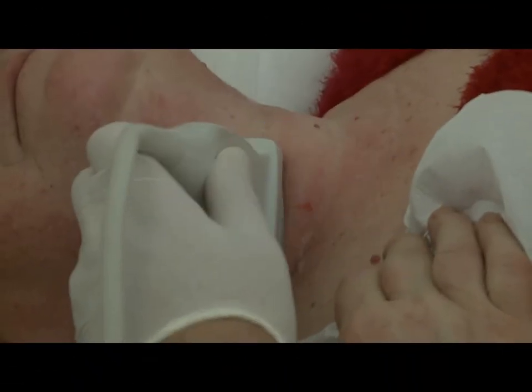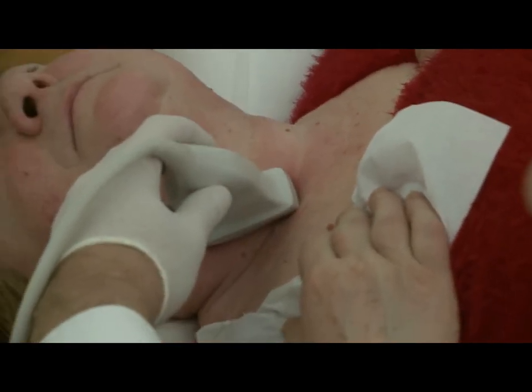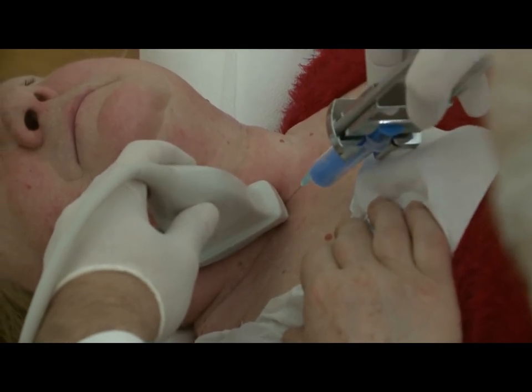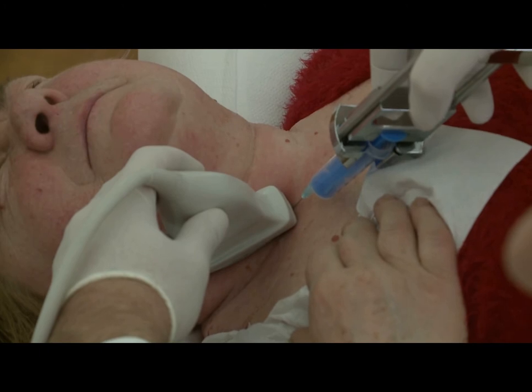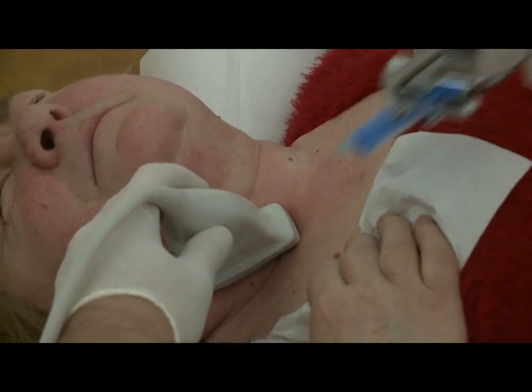Let's see the execution of the other technique — the parallel technique. First, we place the probe on the neck of the patient and search for the adequate position for aspiration. Now we place the needle in the middle of one end of the long axis of the probe. During the aspiration, the needle advances along the long axis of the transducer. When the tip of the needle is in the right position, we perform the aspiration. The procedure is followed by the preparation of the smear.